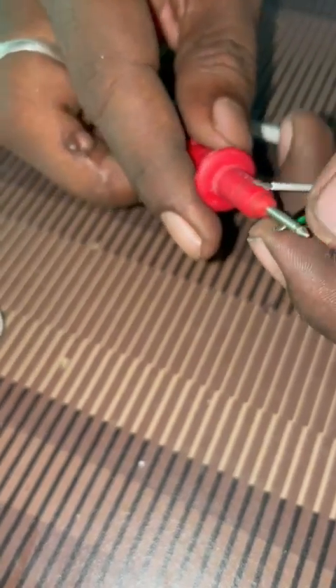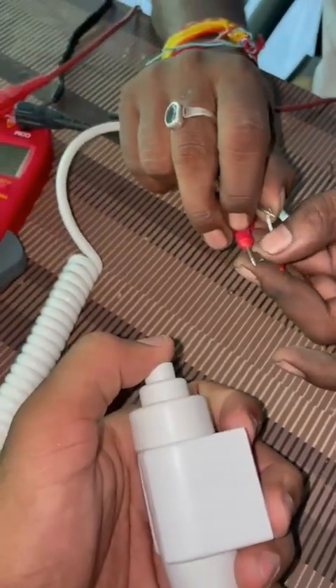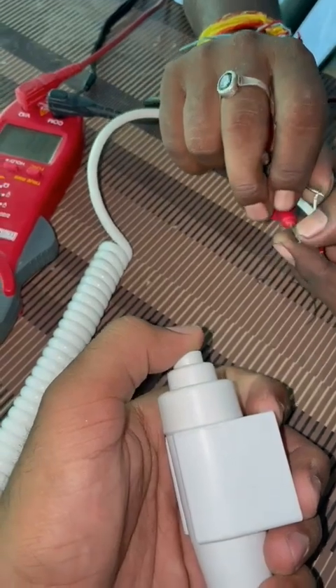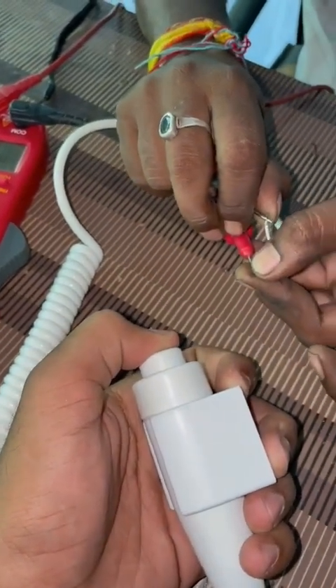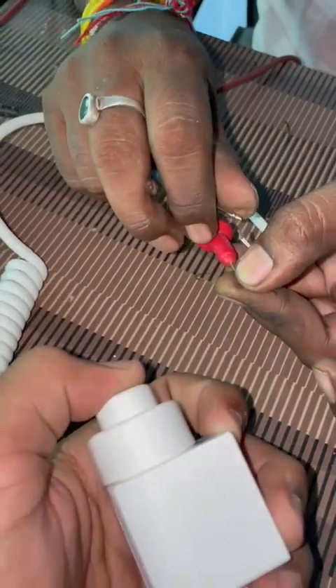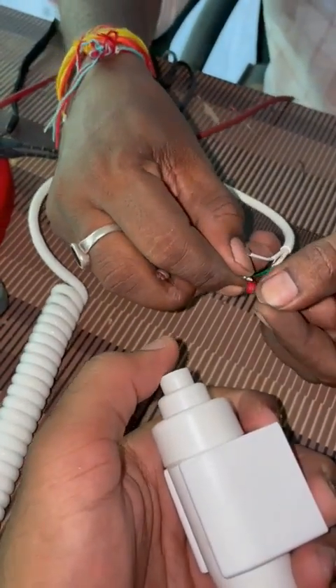If you want to check, then check it. Press the first — look. Press first exposure. Okay, now for second exposure, look.